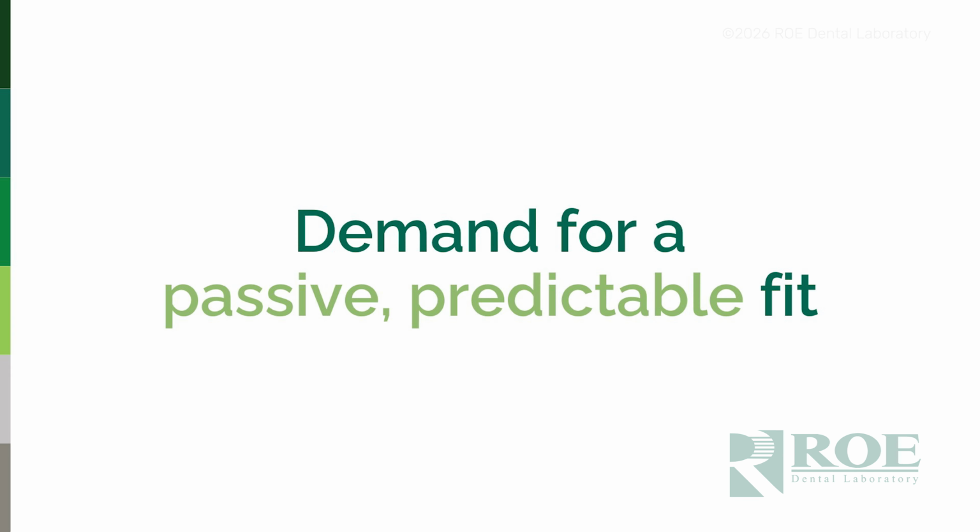But there's also one more thing that we have to think about, and that's really the increased demand and popularity of this word, creating passivity. And often passivity is a little bit misunderstood, but ultimately what we're trying to do is produce a very predictable fit of the final restoration.